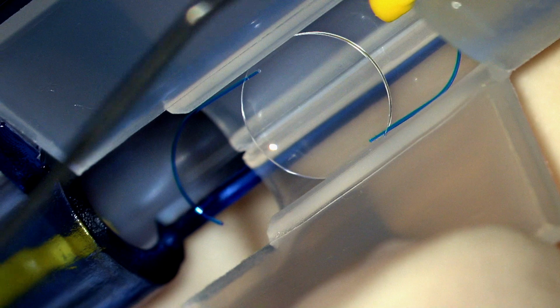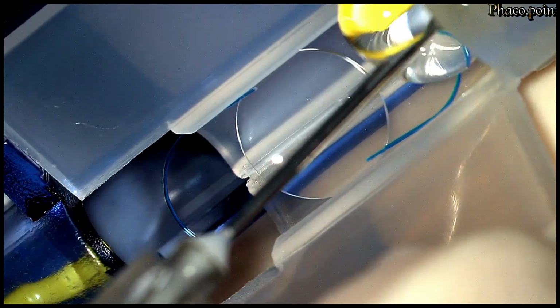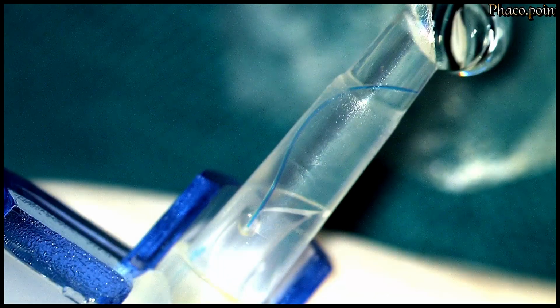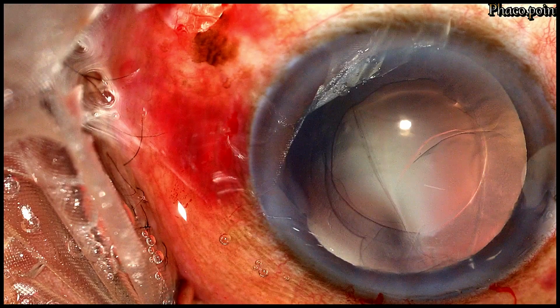This is the 3-piece IOL which comes preloaded. Some viscoelastic is introduced above it and within the nozzle of the cartridge, after which, after pushing the optic down, the cartridge is snapped shut. Then, under direct visualization under the microscope, the orientation of the leading haptic in the cartridge is carefully noted. We now move to the implantation of the 3-piece IOL in the ciliary sulcus.